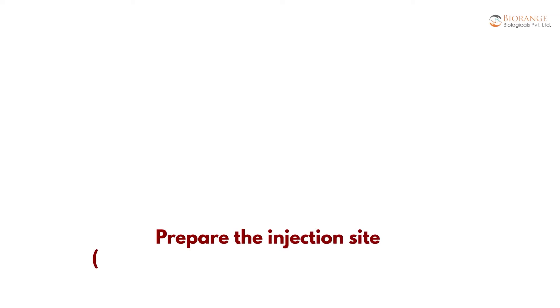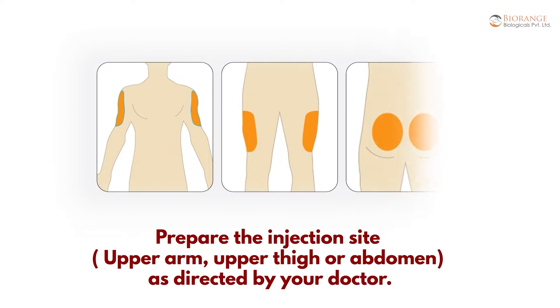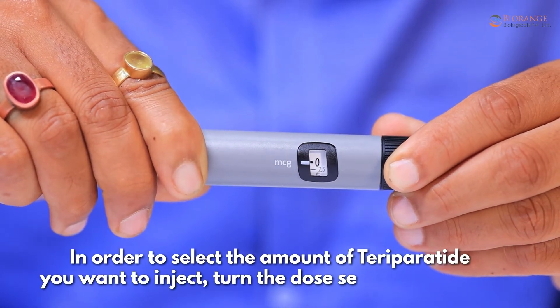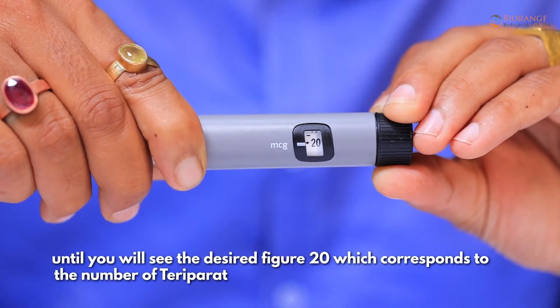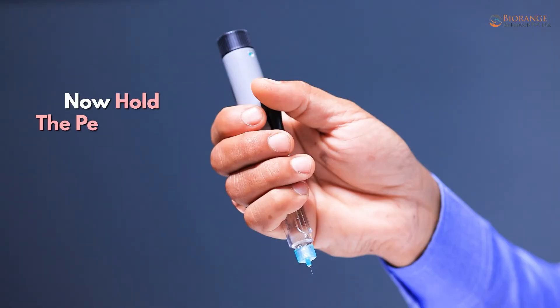Prepare the injection site — upper arm, upper thigh, or abdomen — as directed by your doctor. In order to select the amount of teriparatide you want to inject, turn the dose selector clockwise until you see the desired figure of 20, which corresponds to 20 mcg of teriparatide.